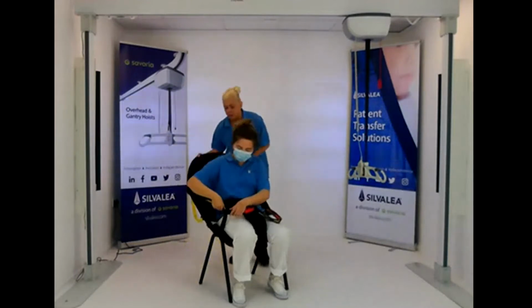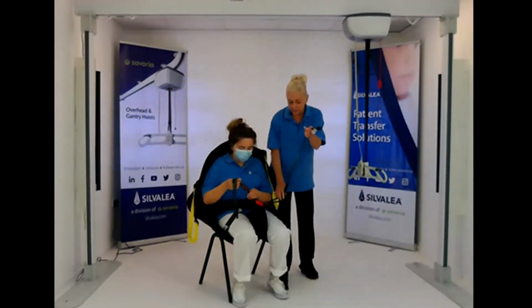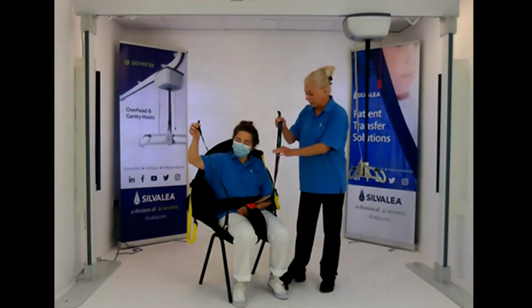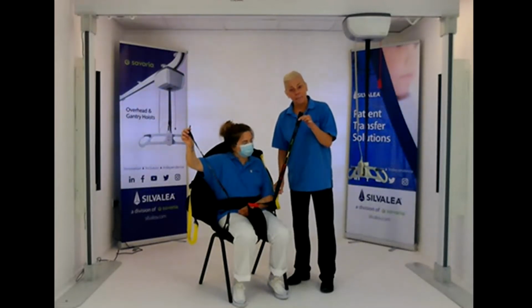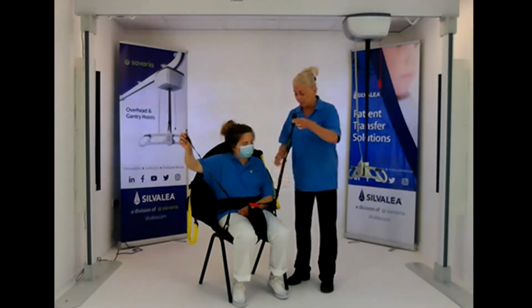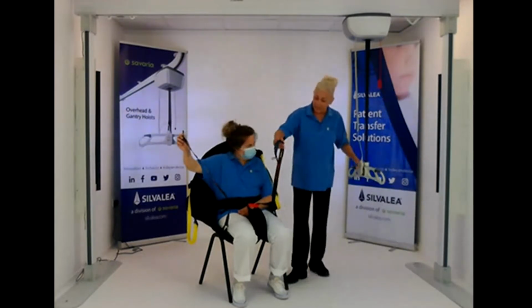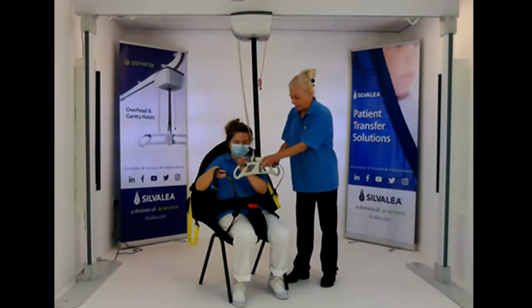And as I said, we've just got to think about the leg section and then the counterbalance. These are our safety slot tapes, slightly different to a standard loop, but works in exactly the same way. They're colour coded in the same way. They're just more streamlined. You can request standard loops if you prefer, but this sample has a slot. So let's go on green.